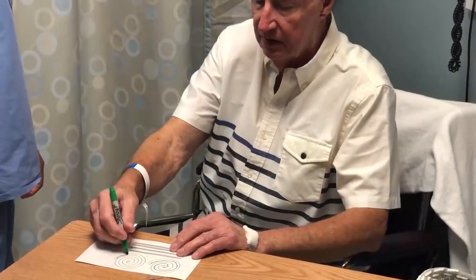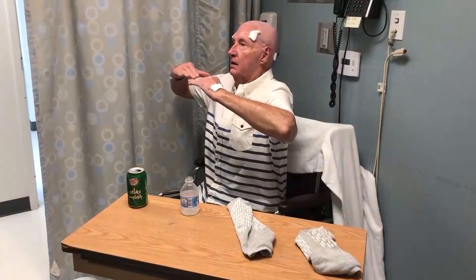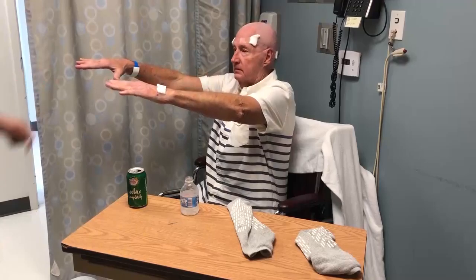Post-operative motor assessments are performed, and in this case, we can see improvements in both intention and postural tremor of the right hand. This concludes our video overview of the focused ultrasound thalamotomy procedure.